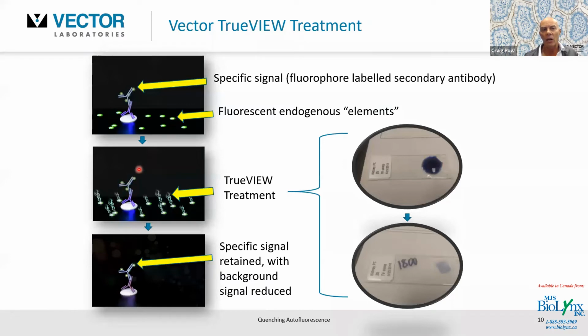After the detection methodology, you treat with TrueView, and the background goes away, this autofluorescence, and retains the specific signal. So hopefully you can see my hands, I'm waving around here. You've got the specific signal and background autofluorescence. TrueView retains that specific signal, but drops down that background autofluorescence from those cellular components I mentioned, and from the use of an aldehyde-based fixative.